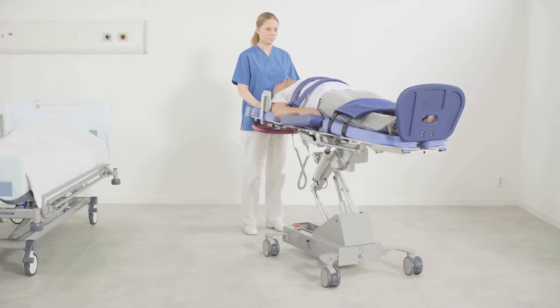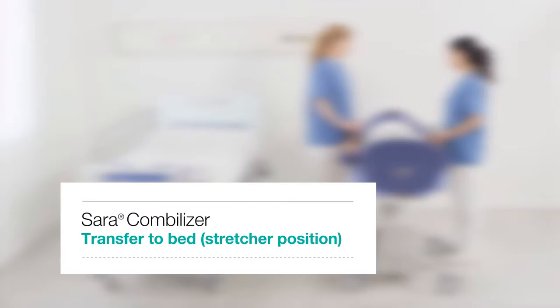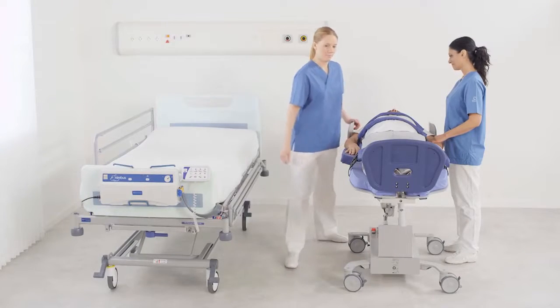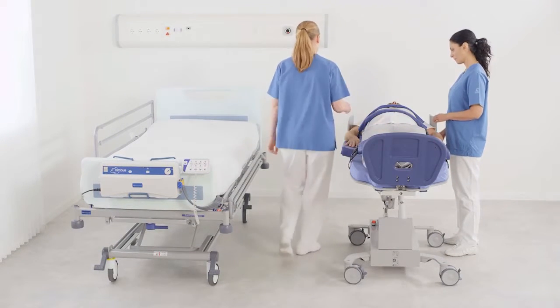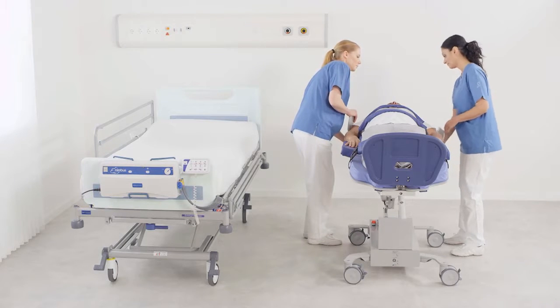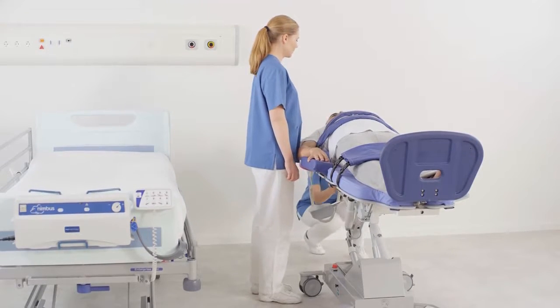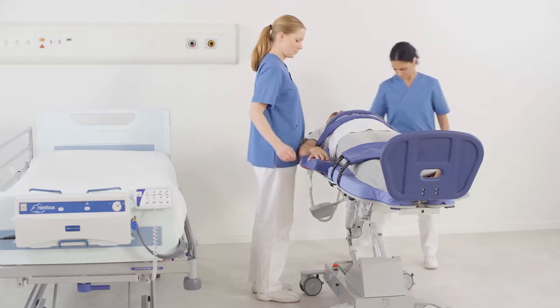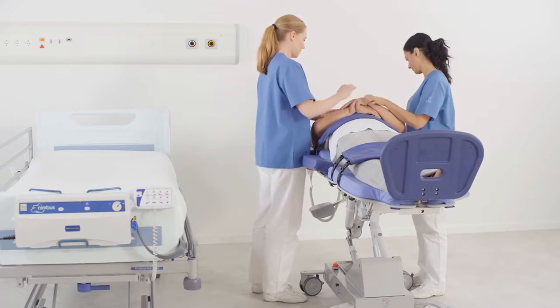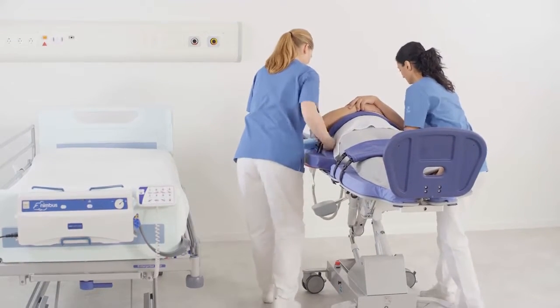Stretcher position is used to have the patient in a recumbent position and for lateral transfers of patients to and from a bed. With Sara Combilizer at a good working height, pull out the foot support or remove it completely. Pull out the spring lock and fold down at least the bed end shoulder support. Release the head cushion strap and place the strap beside the patient's head. Cross the patient's arms in a secure position. Gently pull and fold down the sliding aid underneath the patient.